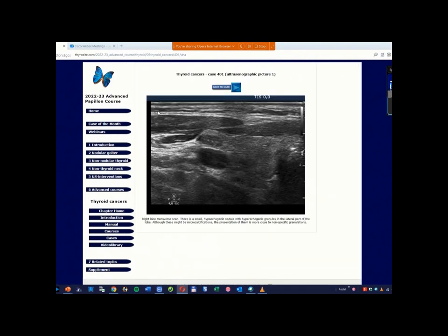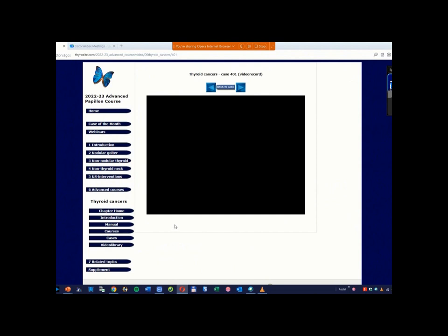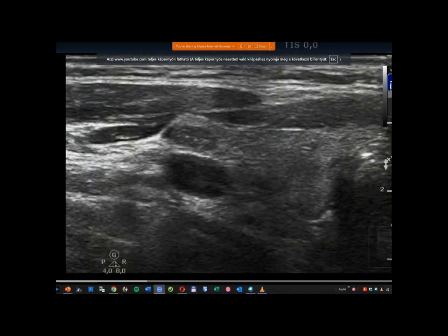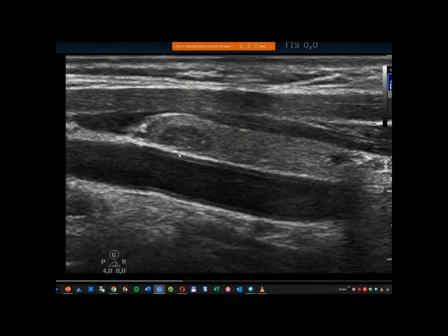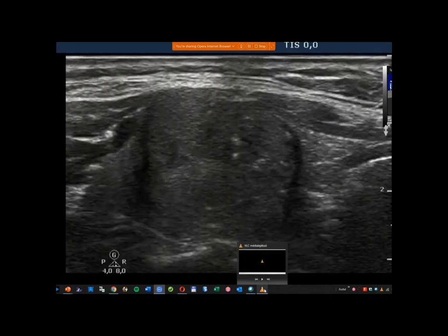Yes. So there is a papillary cancer in the right lobe here, and a medullary cancer in the left lobe. So this is a typical form of amyloid deposit. Isoechoic or echonormal patches, and it contains some echogenic spots. And I have also the video. But this is a papillary and a medullary cancer. So not papillary and follicular, but papillary and medullary cancer. So here is the right lobe with microcalcification, the left lobe with amyloid deposits.